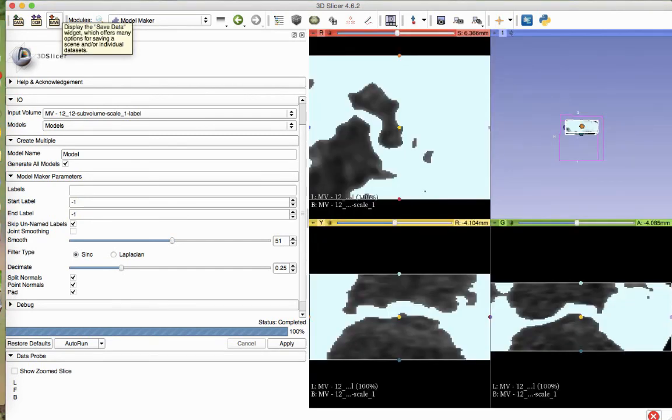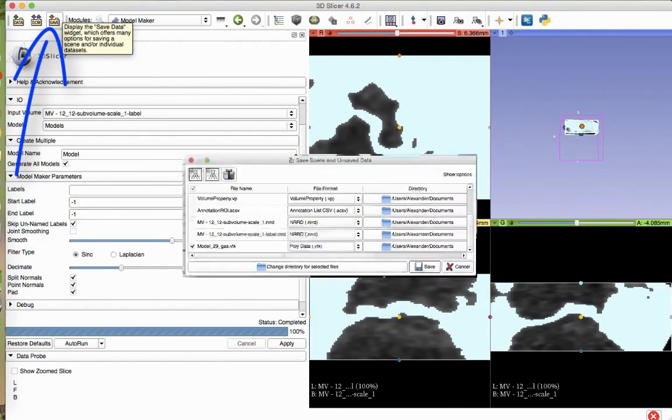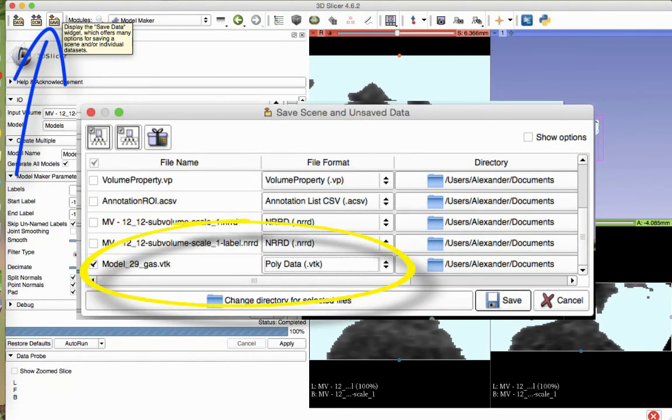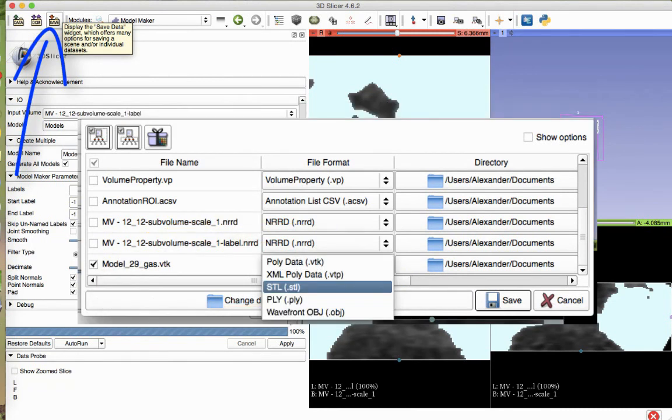To save your model, select the Save button. A list of options will be presented in the Save Scene and Unsaved data box. Scroll down until you see the polydata.vtk file. In the drop-down menu, change this file to the .stl type.